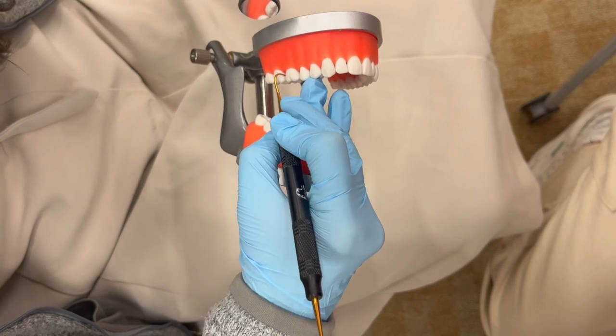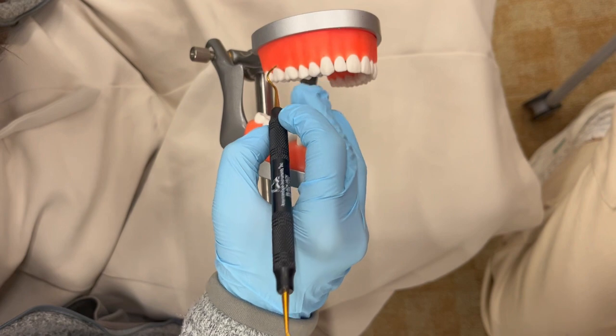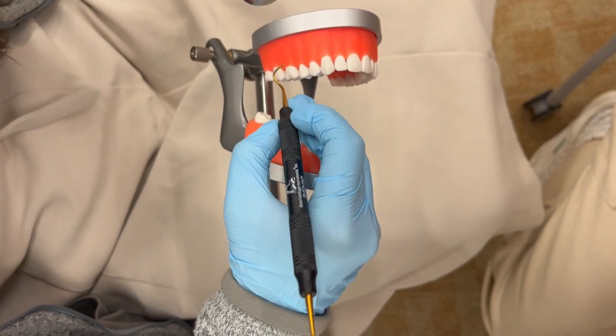So the lower shank is parallel to the distal surface, and the functional shank goes up and over the tooth. So a good memory aid would be to think that posterior equals parallel and the functional shank up and over.